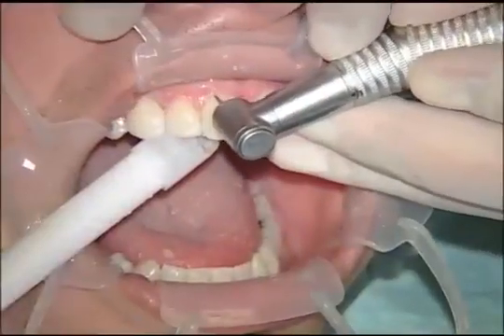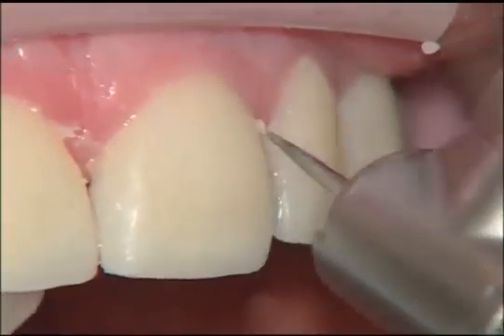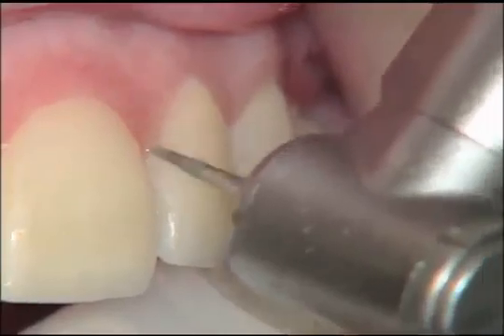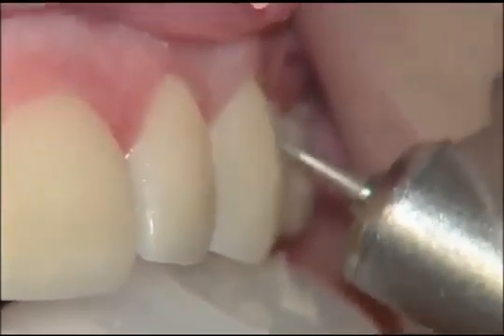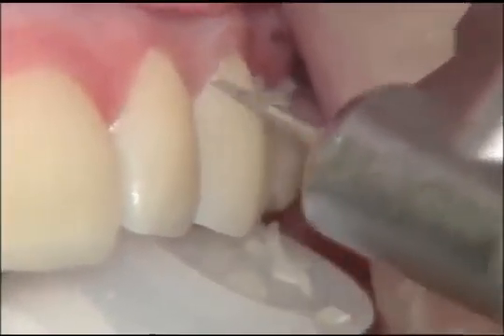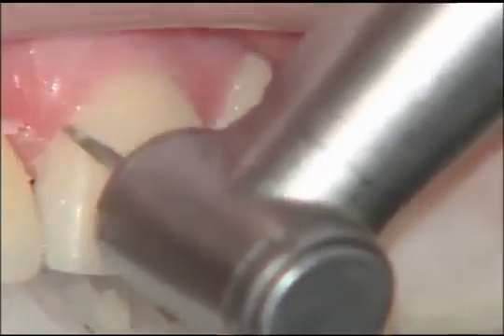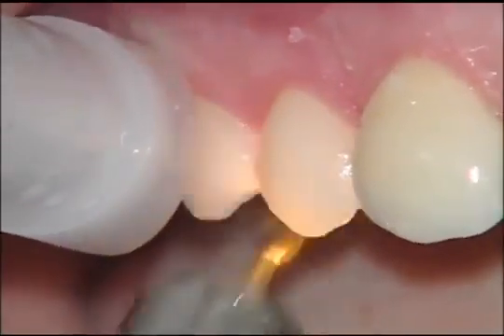Now what I'm doing here is I've got a fine diamond finishing burr that I'm using to go around the margins. I'm not standing on the rheostat at all, so the burr is not spinning. What I find is these finishing burrs work very well, almost like a scalpel, except it's not sharp, to go around the gingival margin and remove any small overhangs of cement that are left. They really do a great job because they're thicker than an Explorer and they have an easier time. They don't bend like an Explorer, and so as you use them, you're able to pop that extra cement off. If you do find you have a bulky margin, as long as you're in there with the burr, you can go ahead and smooth that down at the same time.